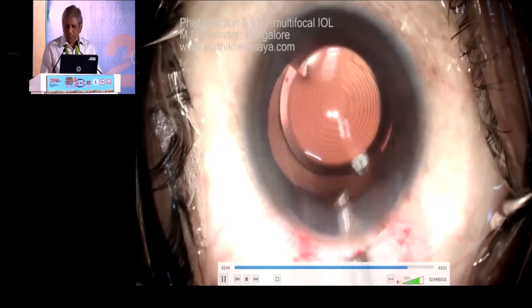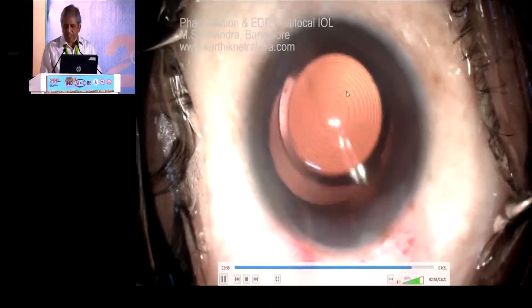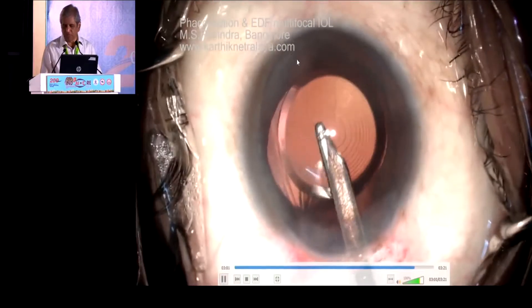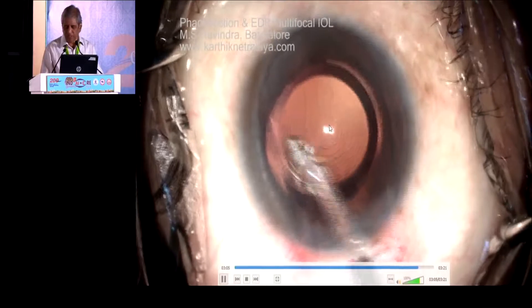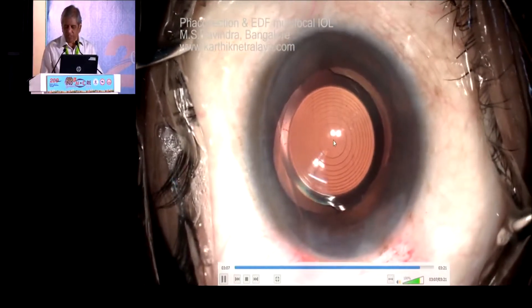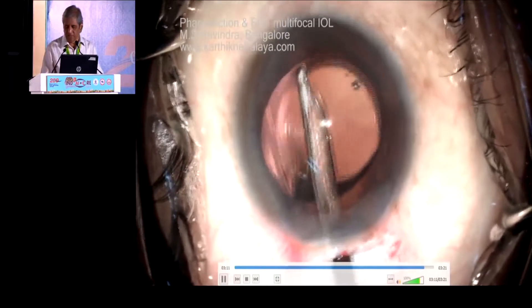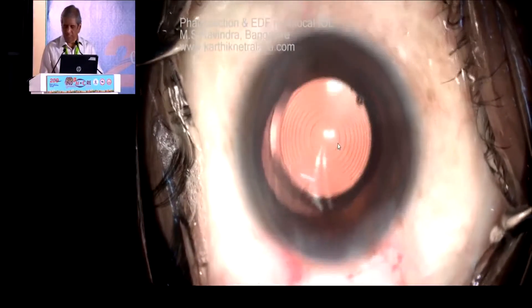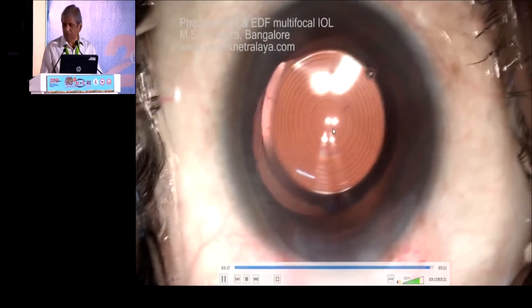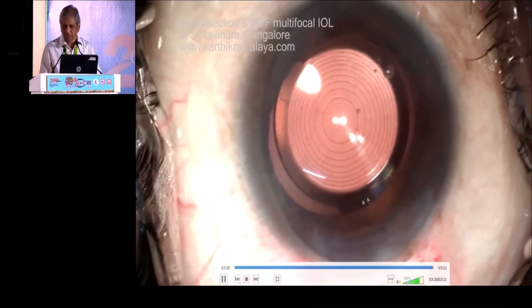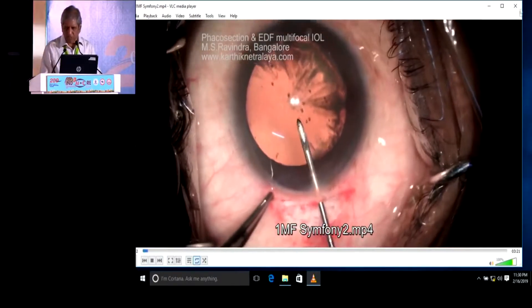You can push it in a direction, rotate it if you want, in such a way that the Purkinje image is centered. Now it's not centered because one side is slightly pushed. Keep forming the chamber. When you form the chamber, ultimately the center of the first ring should correspond to the Purkinje 1 image. If you have achieved that, the patient will see well. That is the target you have in multifocal lens implantation.